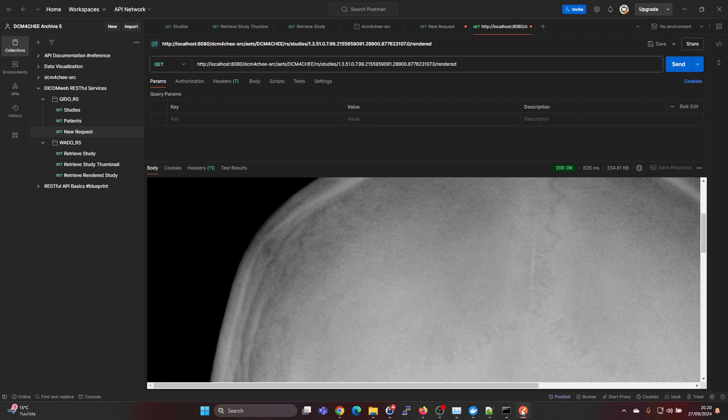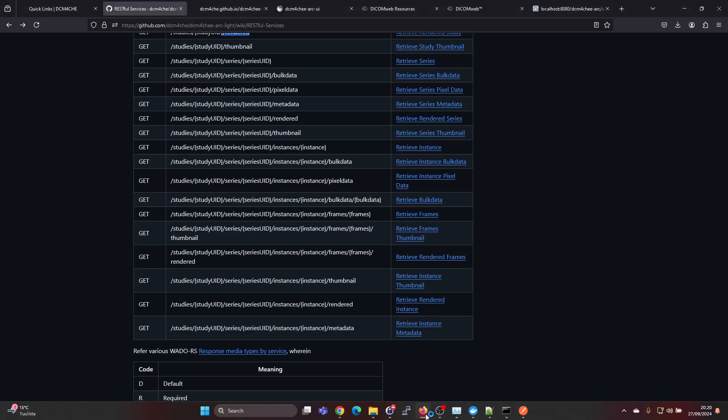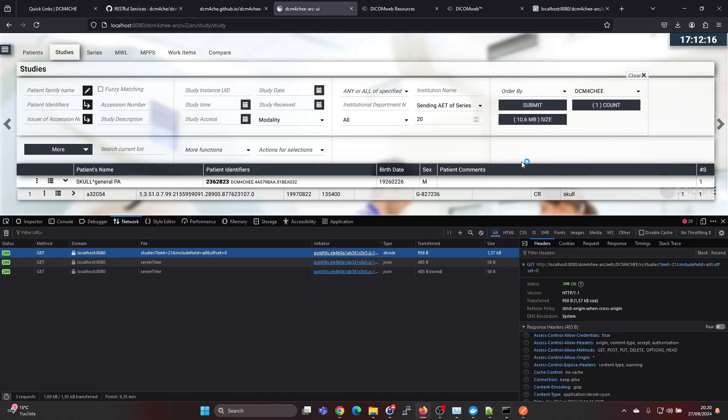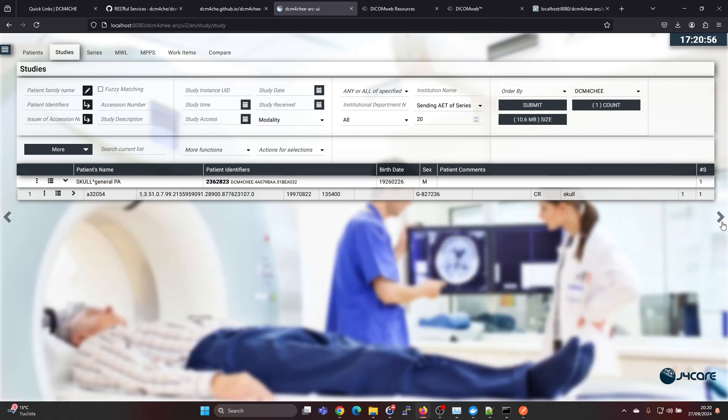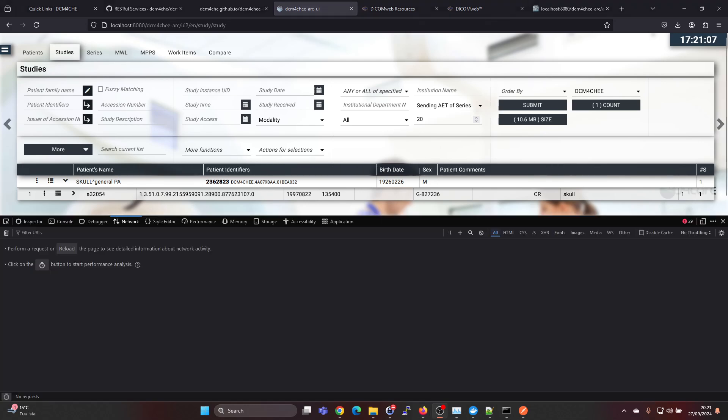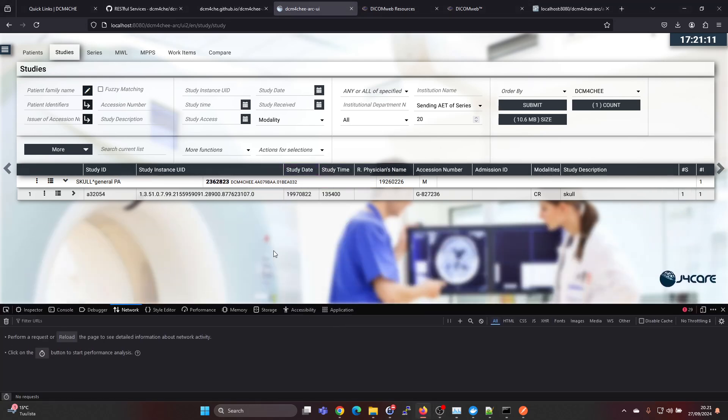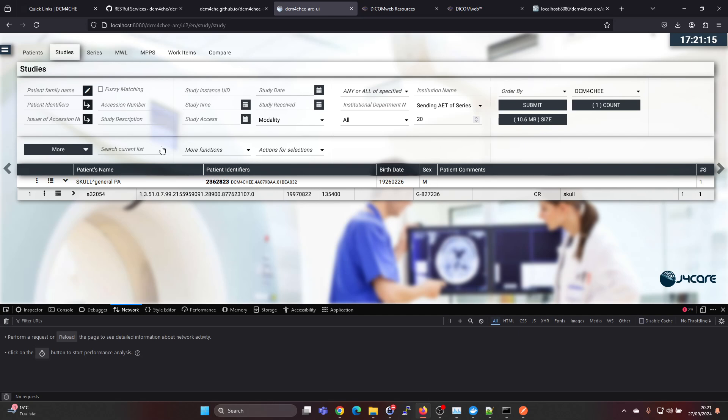If you still maybe need help with uploading a study into the Dicom4ChE archive, I'll just show you that briefly because it's actually quite easy to do as well. Let's just leave this open so we can see the StowRS, like what's happening there, because this is using StowRS to push the study.